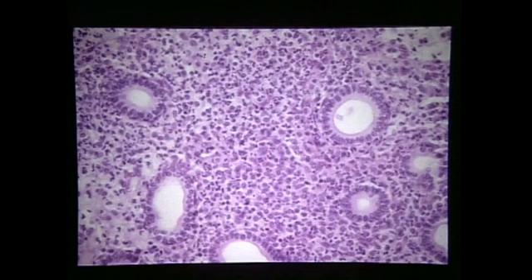And here is such a situation relative to an inflammation, a severe involvement, separating glands and destroying glands, which would also lead to a category 3 classification. An example of splitting of elastic fibrils in a major vessel, as demonstrated by this special Van Gieson stain.